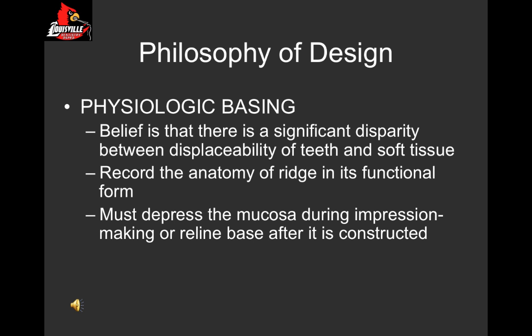In order to reduce these forces, though, you must depress the tissues during the impression-making procedure, or else you have to make the denture and then reline it so that you are again getting some additional functional loading under that denture base.